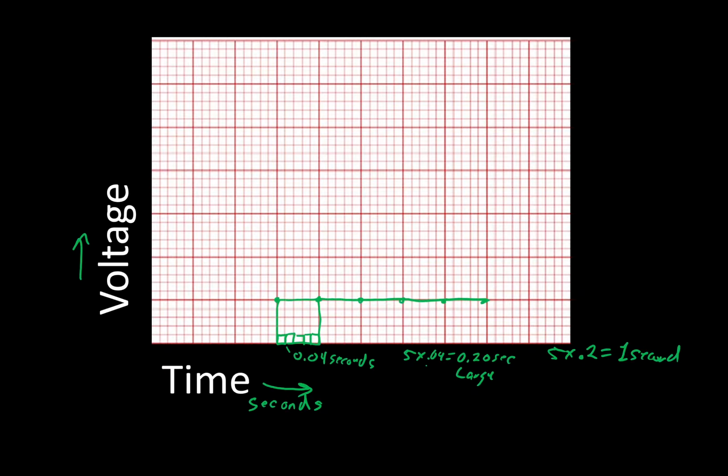And that's just the general idea of how we do timekeeping. And so when we do any measurements on any types of rhythms, we talk about how many seconds long it is and things like that. Well, you can also just communicate and say small boxes, assuming that everyone knows you multiply times 0.04 to make sense out of that.